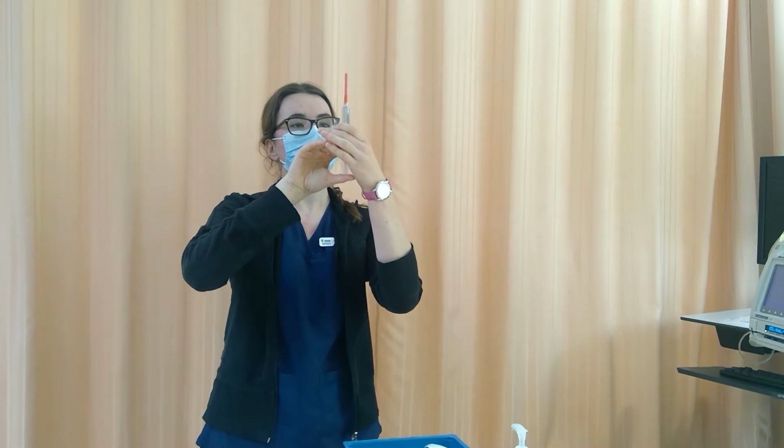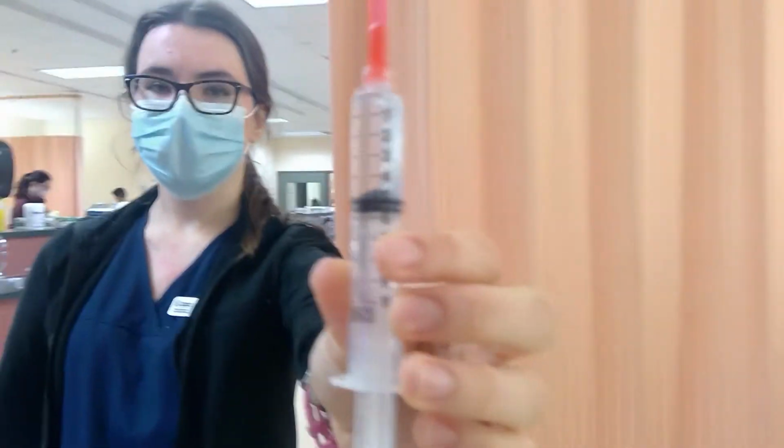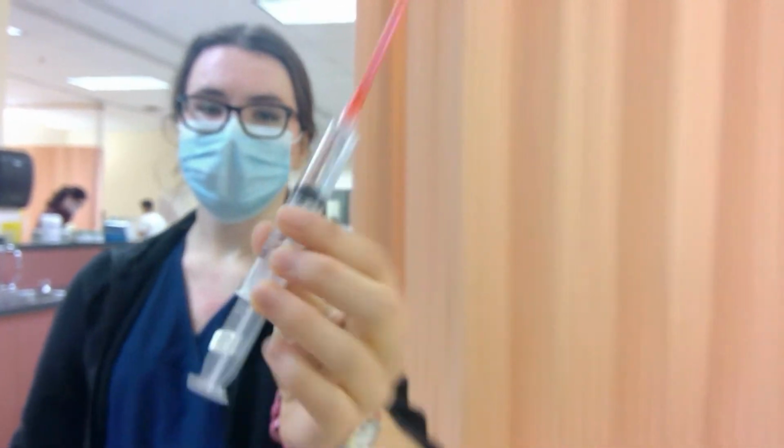And I'm going to come back to make sure that the primary IV is running again. We're at exactly 5 milliliters of medication. Here is your call bell. Press it.